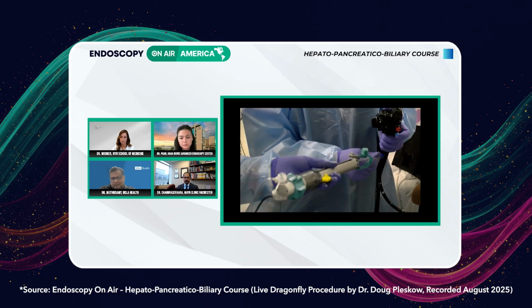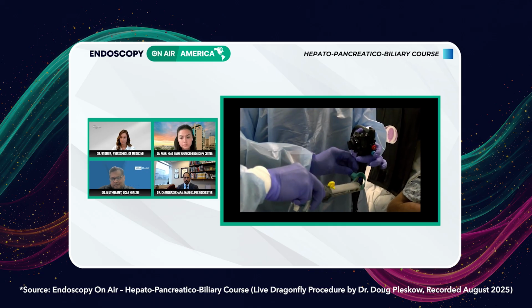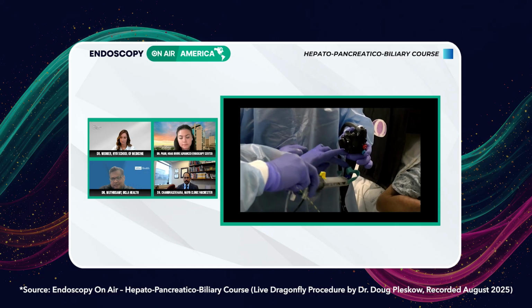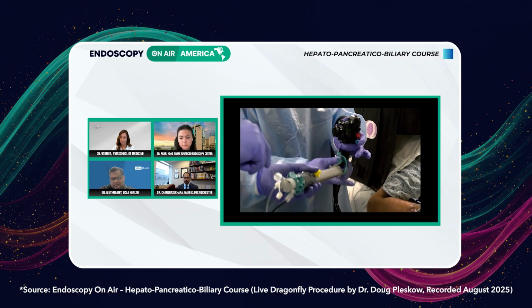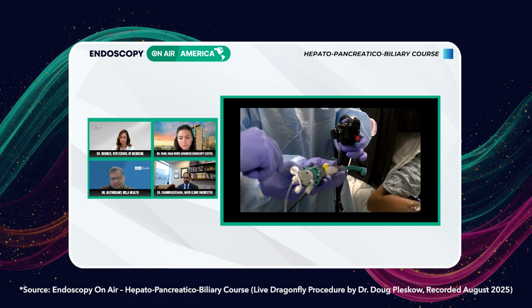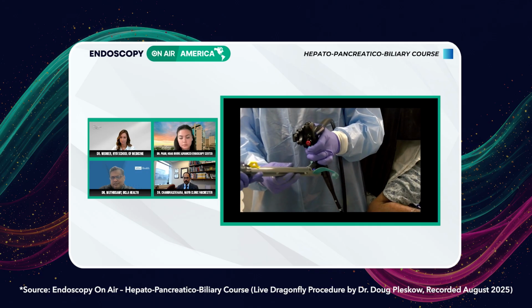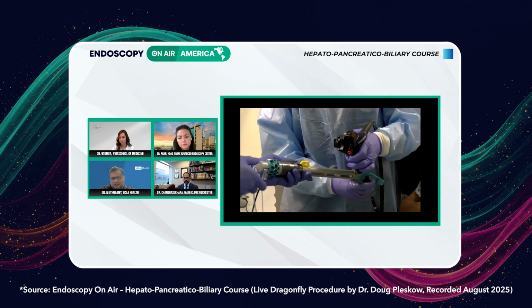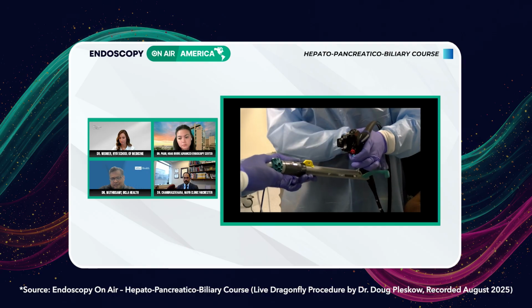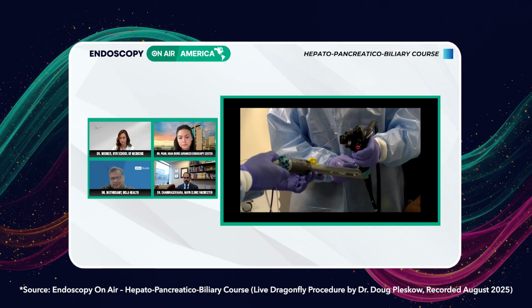This is going to connect right on top of the scope. There's that blue plastic, which will come around. It looks like the traditional way to attach instruments. We're going to point this way, push this down over the suction channel, and then wrap this around, and then it's going to click onto the instrument.